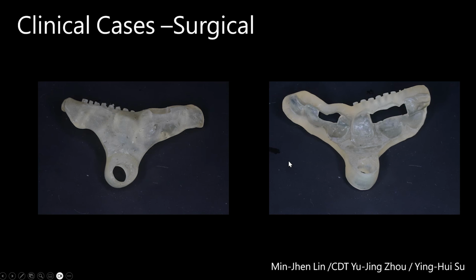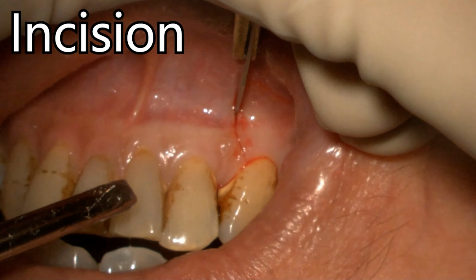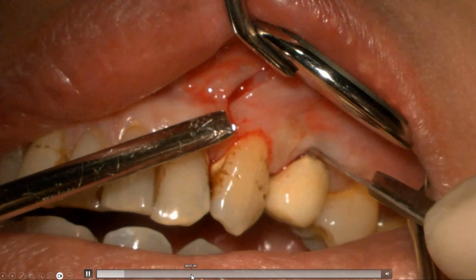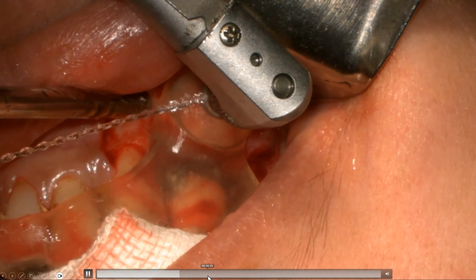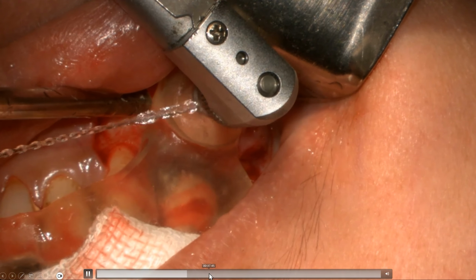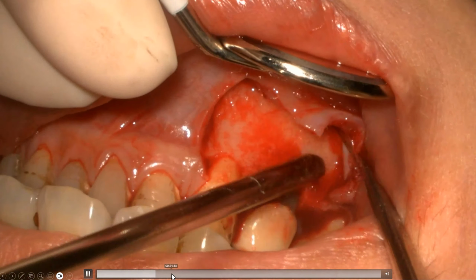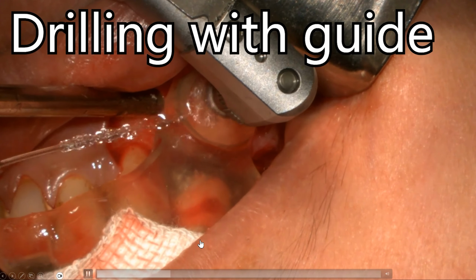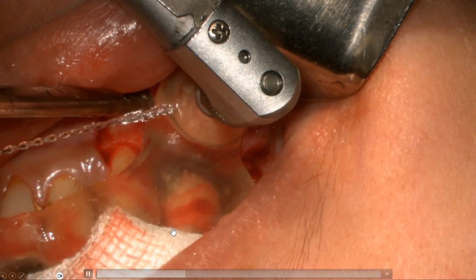And here is the video where I do the incision. I only have maybe 14 minutes, so I jump to the part where I drew the guide. As you can see, I will put the gauze here, and I will tell the patient to bite. When the patient bites, the plate will be stable. And I can put a retractor here, and the guide will help me to retract the flap.